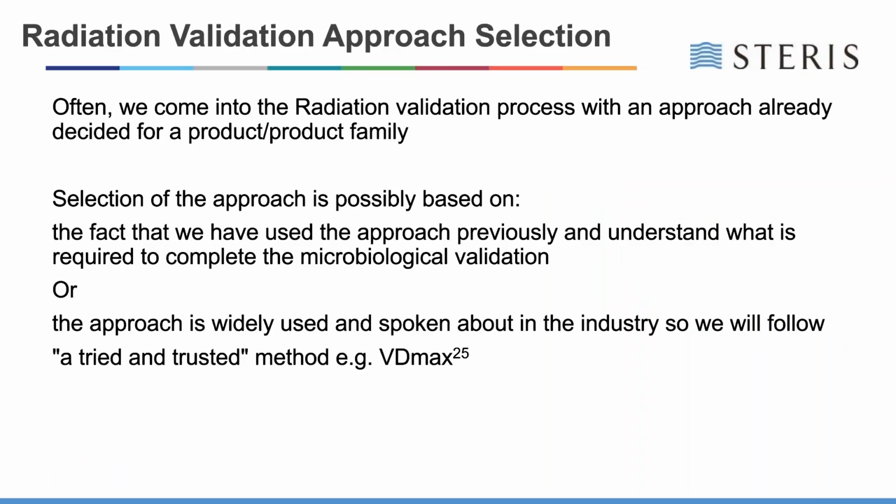Often we come into a radiation validation with an approach already decided for a product family. Some of the possible bases for this approach is maybe we've used this approach previously and we understand what's required to complete this microbiological validation. Or perhaps the approach is widely understood and talked about in the industry, kind of a tried and trusted method. For example, maybe a VD-Max 25.